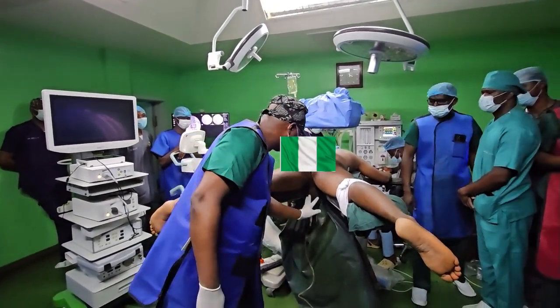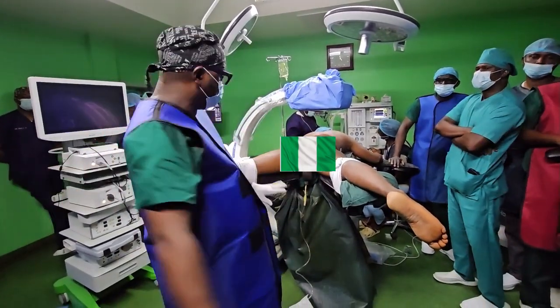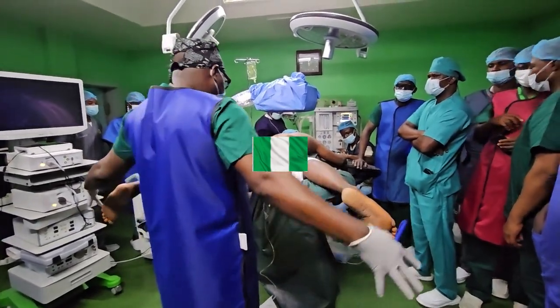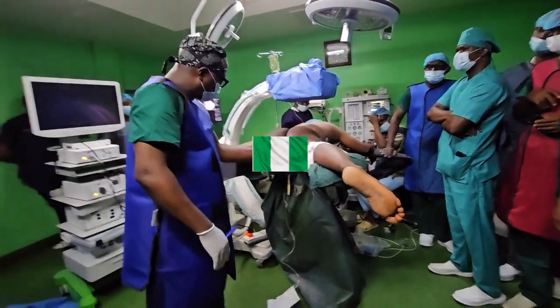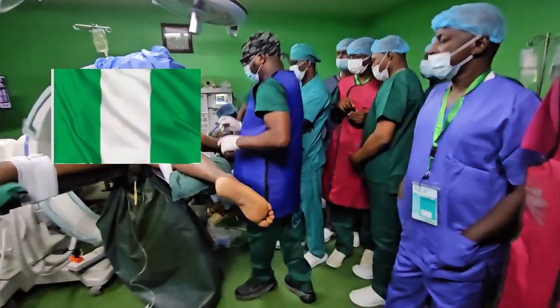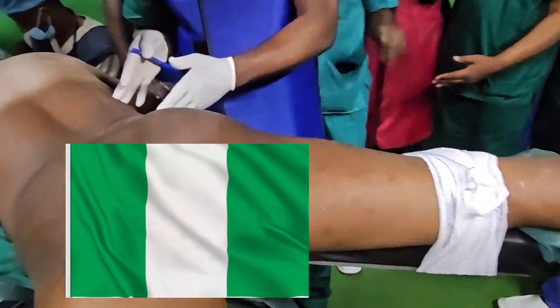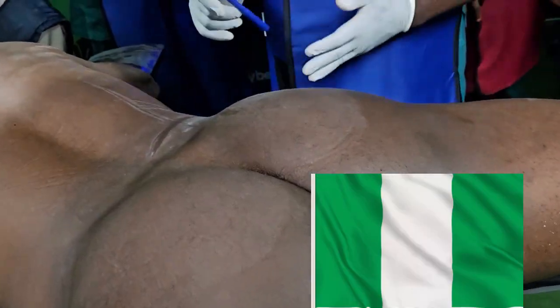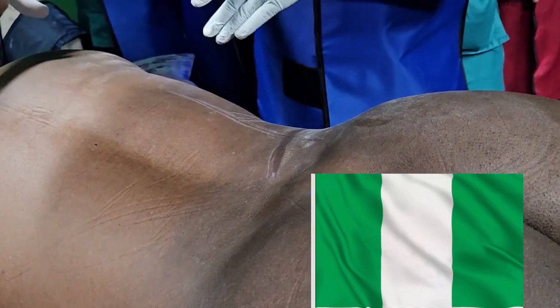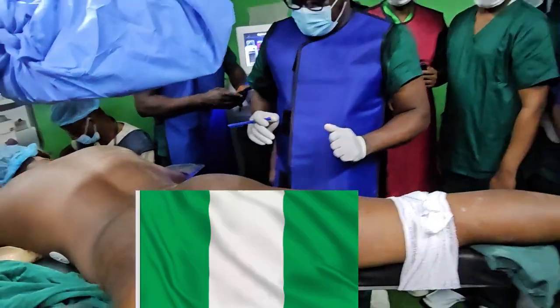We prepare this way and prepare the phallus and all of that. So initially we get a drape that we put under to secure this. Then we put on our TUR drape and bring the phallus through the hole like that. On this side, I'm going to cut a space in that TUR drape to give me access to my field. Okay? The entirety of the drape goes to the anesthetist to screen us away from the anesthetist.